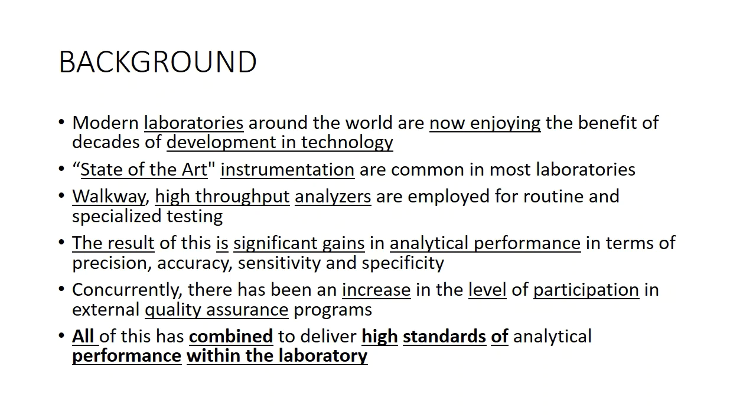But everyone till now has concentrated on better technology in the analytical part. Everyone has very good quality machines, right? Vendors like Siemens, Roche, Beckman Coulter, Abbott, everyone has very robust analyzers. The days are gone when people used to test everything manually, mixing reagents, pipetting, etc. Everything is now automated. Most of the good laboratories, at least in the cities, and tier 2, tier 3 cities also, have auto analyzers, semi-automated or fully automated. So the state of instrumentation is common in most laboratories.